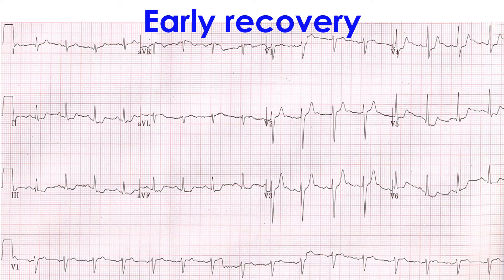The recording in the early phase of recovery at 1 minute shows very little ST segment depression, making us suspect further whether the earlier recording was really due to myocardial ischemia. But the ST segment is down-sloping in inferior leads.